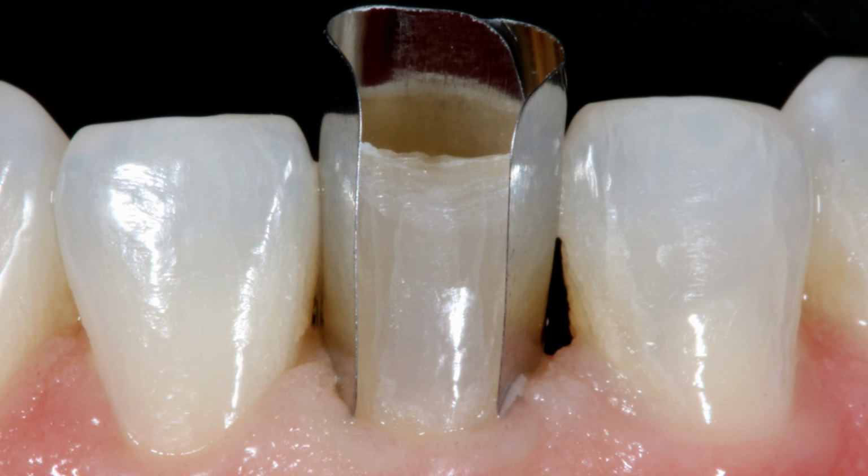I had been using this anterior system for just a few days, and it was going so well for the maxillary restorations I tried that I wanted to incorporate it into lengthening this tooth. When we lengthen these teeth, it's not just a mesial or a distal, it's basically mesial, incisal, facial, lingual, and distal, and sometimes that can be a little tricky. You've got five surfaces. Right, we're playing with everything.